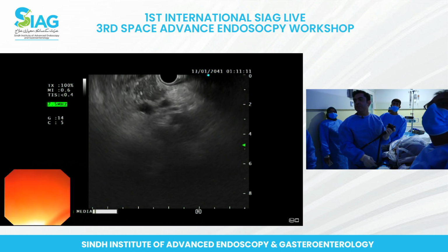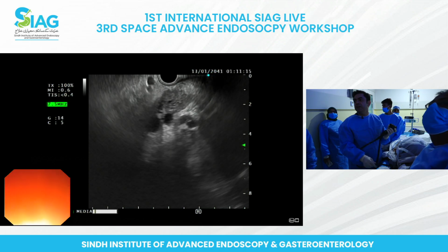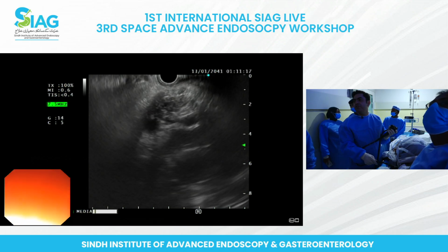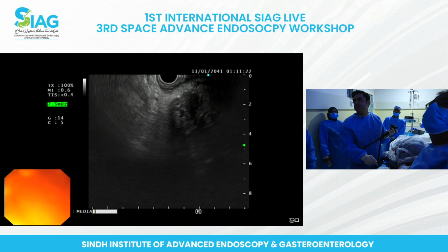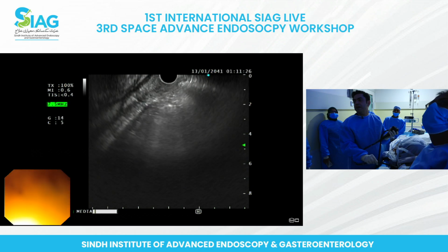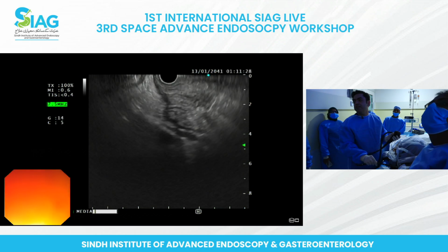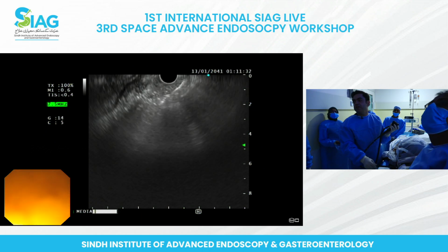So obviously you can see the pancreatic tissue just above the splenic vein and the splenic artery. And then at this point, obviously, where it dips down, this is probably the surgical margin here, I would have thought. But I can't actually appreciate the 10 centimeter collection that they have mentioned here on the CT.